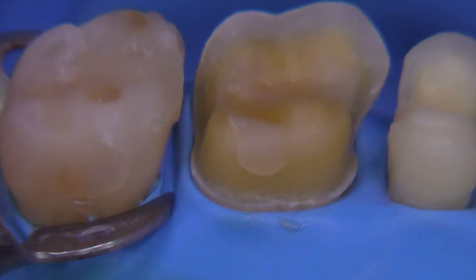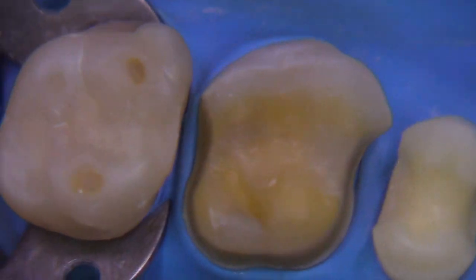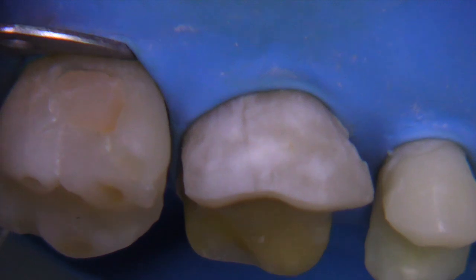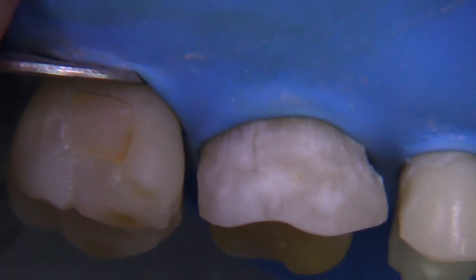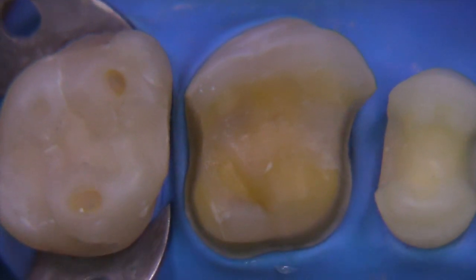The same finish line. You can see that we have these little hourglass forms on the mesial and distal for resistance form. For the full crown preparation, obviously these are not going to be necessary, but I thought it'd be nice to just take a look at this in comparison to our preparation today.